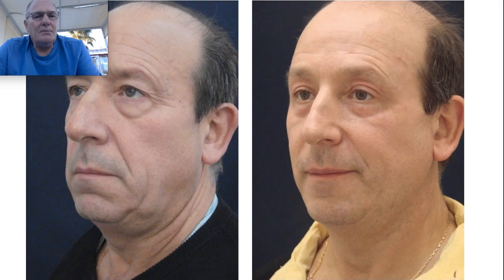This is 2 months after the procedure. I reposition the forehead and use laser technology in this area, also without removing skin. You can look for my personal technique, blepharoplasty. You can see here how it is possible to reposition all the forehead and the eyebrow without removing skin, and you can produce a change of the look of the patient.